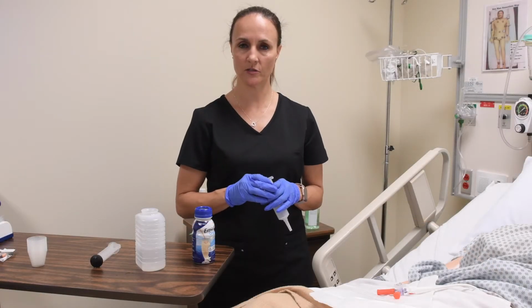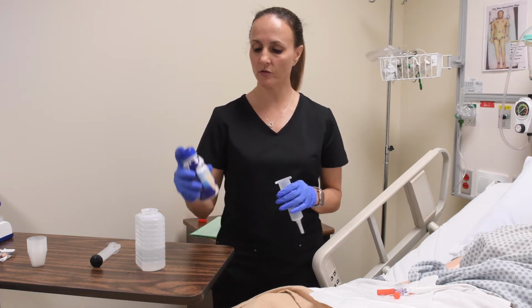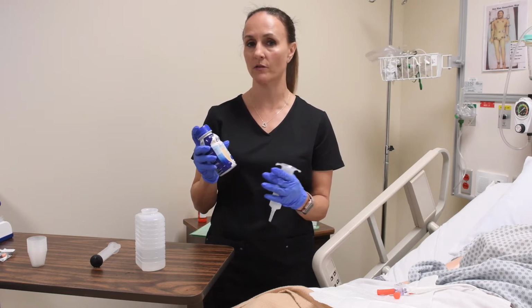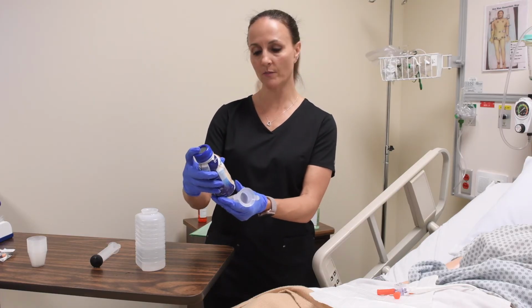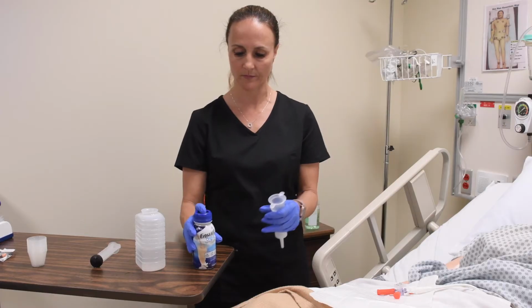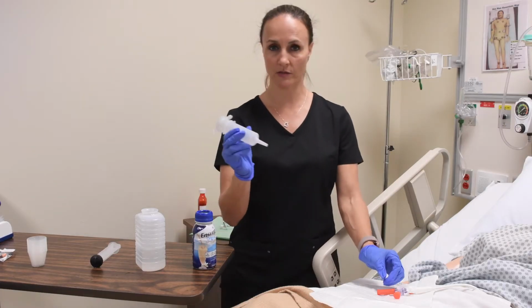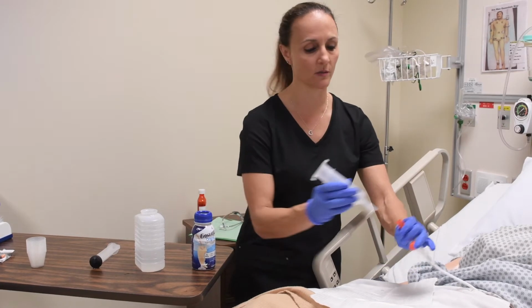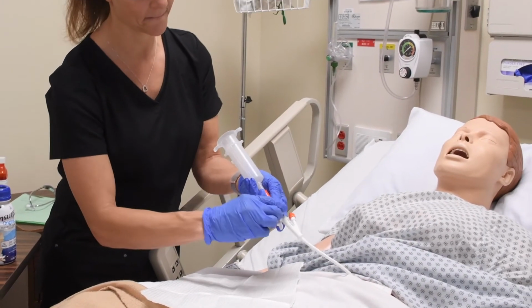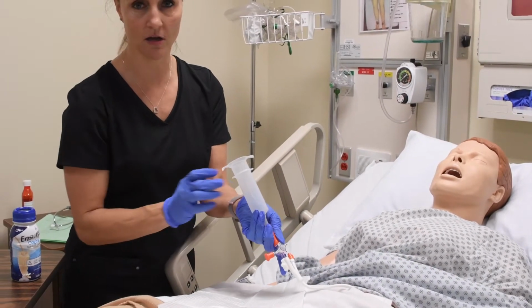Now it's time to administer the feedings. Make sure that you know the exact amount of how much you're going to give to your patient because this is part of their intake. So according to my bottle, I have 237 mLs of feedings. Again, I'm going to attach my 60 ml syringe to the PEG tube. Turn it to the on position.